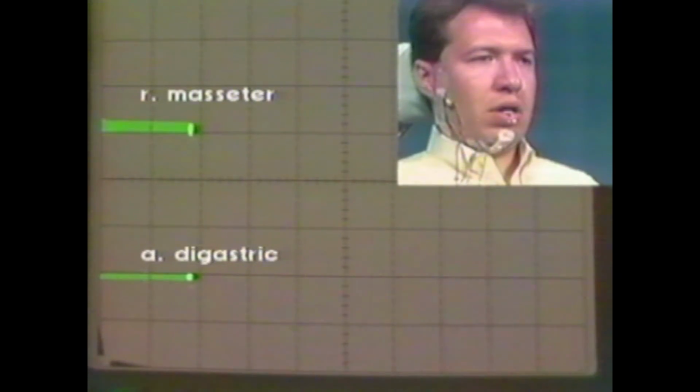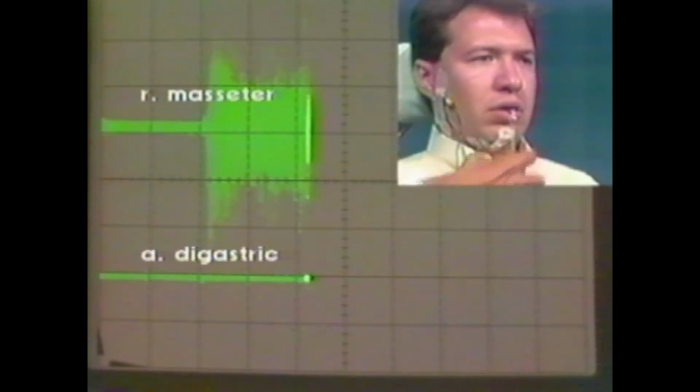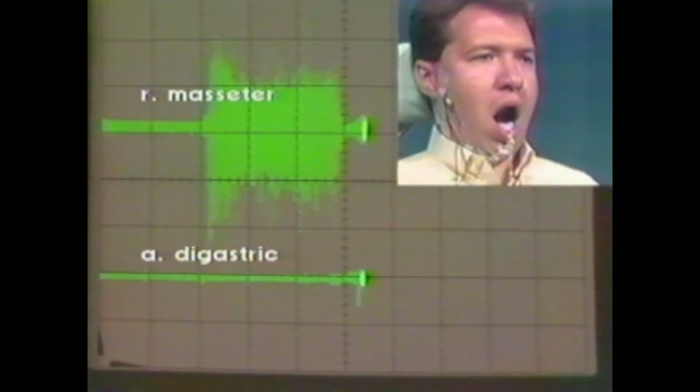The subject will bring the teeth into maximum intercuspation, and an increase in EMG activity is recorded. A 500-gram weight is added, and the subject is instructed to lower the jaw, then elevate the jaw. Note the recruitment of masseter muscle fibers to perform work. The jaw will be returned to the clinical rest position, and the weight held in this position.